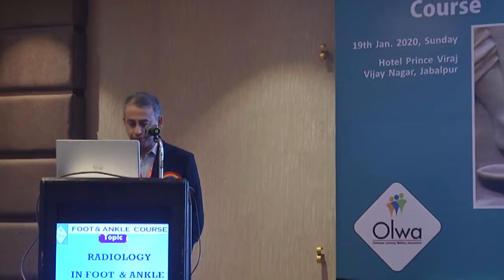This is the way you take a foot weight-bearing X-ray. If you do not take a weight-bearing X-ray, the projections are not proper, and a lot of things can be missed. So always in a cold condition, take a weight-bearing X-ray, anterior-posterior and lateral view of the foot, and this is how it will look. There are a number of things which we can pick up on weight-bearing AP and lateral X-rays. The third X-ray obviously is an oblique of the foot. Depending on the condition that we want to diagnose, we will take it.